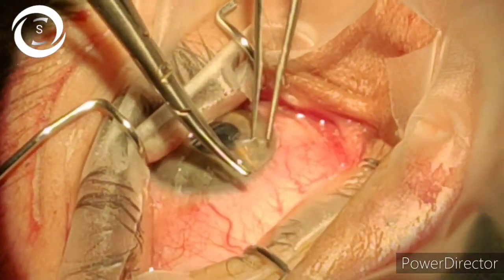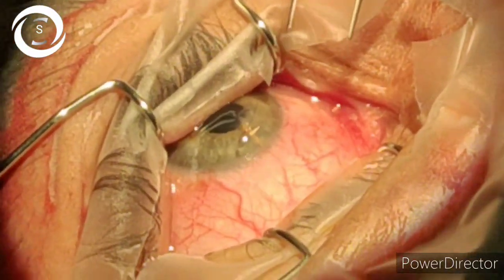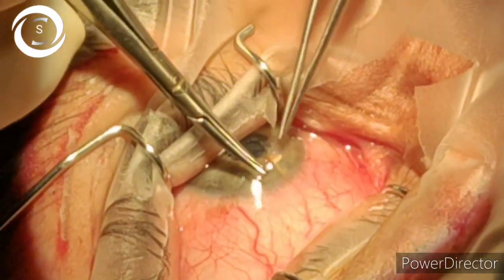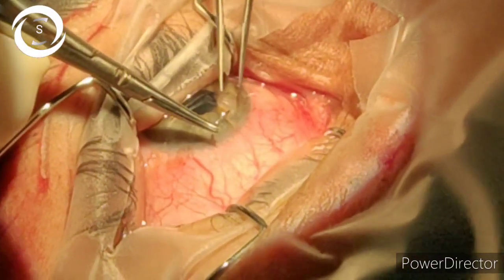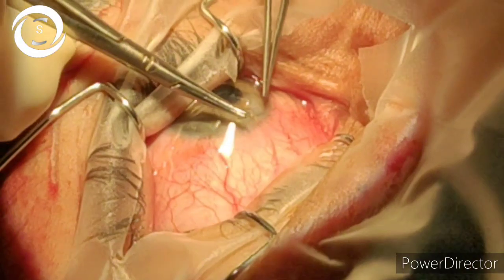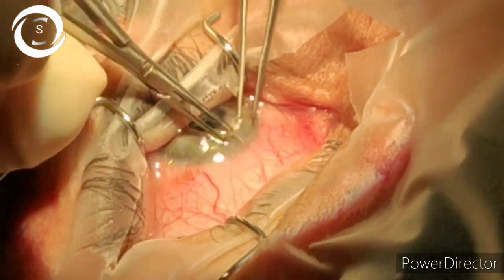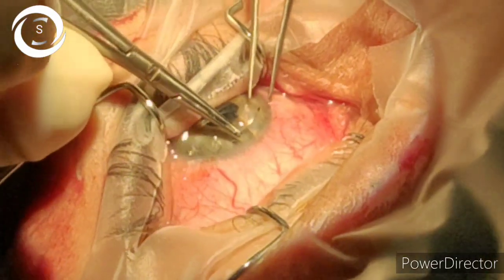The first suture is always very challenging whether you are performing keratoplasty, a corneal tear repair, or even extracapsular cataract extraction. As it was under topical anesthesia, the patient was moving the eye superiorly due to the protective Bell's phenomenon, but as the wound was inferiorly located, this was in a sense good for us — there was proper exposure.